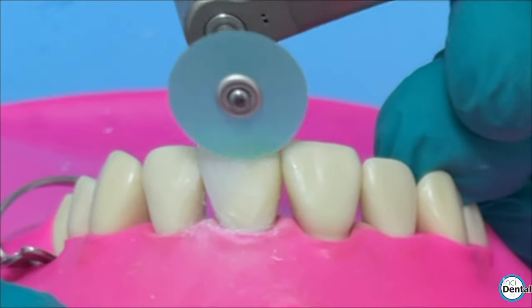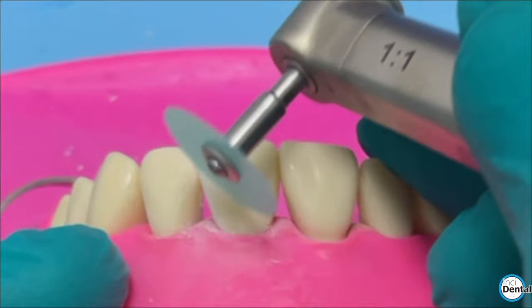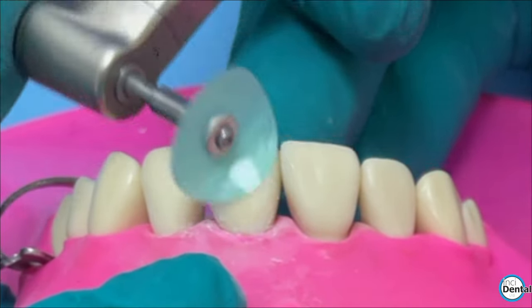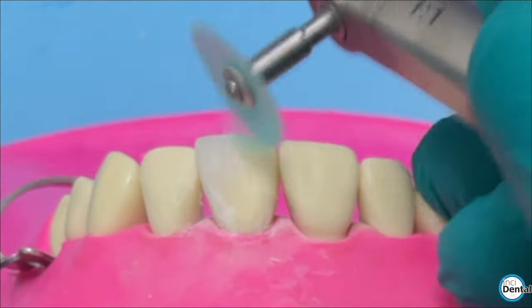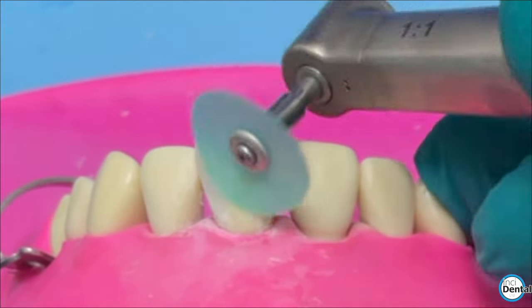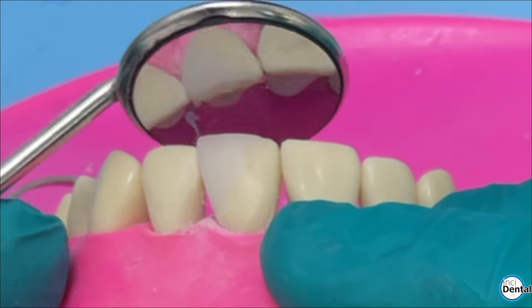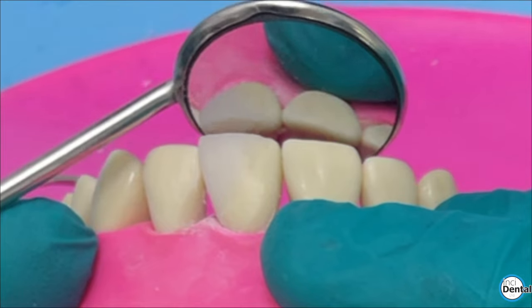Then I'm going to the green disc for contouring — again with the large 14 millimetre disc, so it's nice and broad — just trying to bring in that facial surface. You can use any grit you want; it's about control. I'm not running these fast — 10,000 RPM maximum, and often slower than that. Pick your grit and speed so you've got really good control and can nudge it to the shape you want. The key thing is to look down the long axis, check you've got that facial plane correct, and try not to move on until you have.